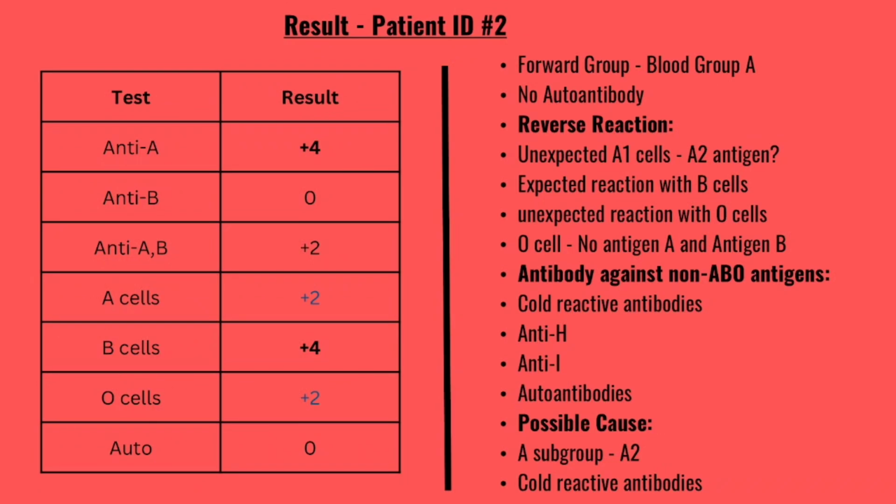However, there's a problem. I'd already mentioned that this weak reaction we have of +2 here, which is under anti-A and B, I would have expected it to be stronger, but for this presentation, I'm going to say that is still fine, because it can be argued that it is reacting to the anti-A here, not the B, and maybe the competition there, as the case may be, is what gives it that very weak reaction. But I would have expected it to be stronger, but let's not worry so much about it.